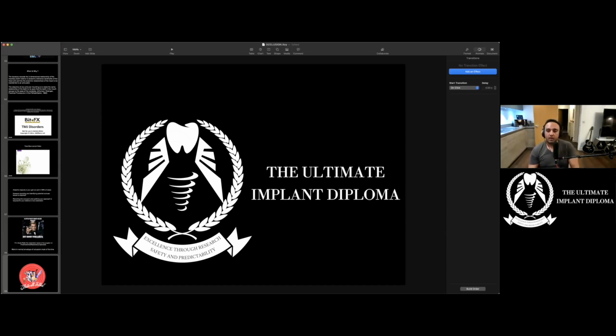So I mostly can conform, but I won't do anything, again, just trying them. When you're doing all on 6, I do 6 implants as a minimum. I won't do all on 4 very often. But if you're putting those implants in, you've got to use a temporary prosthesis to try to train your patients into the bite to make sure that they're comfortable, right?